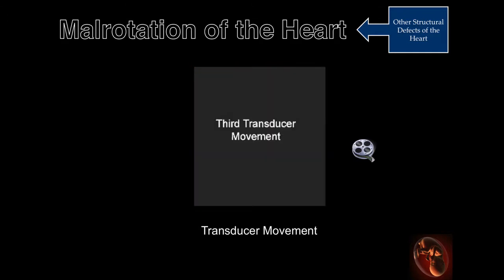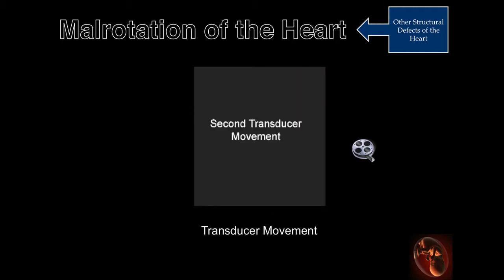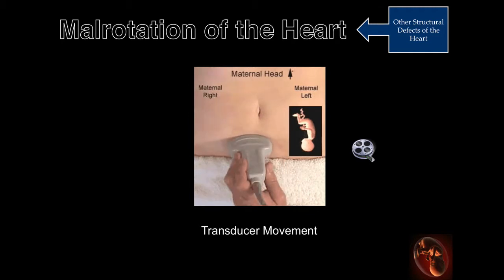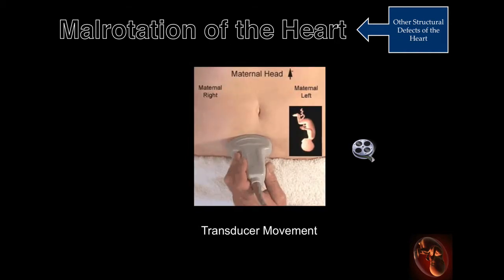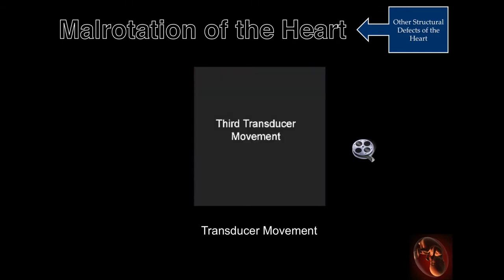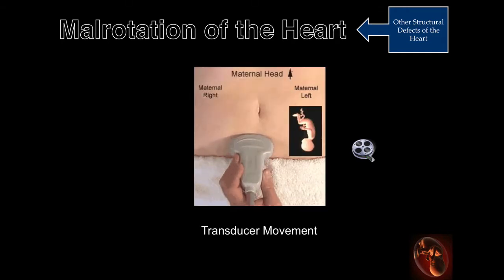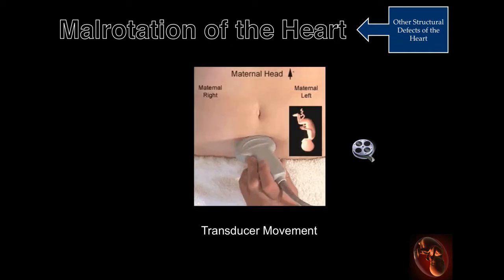One of the more difficult challenges is the identification of correct situs in the fetus. The next two slides will illustrate one technique for accomplishing this task. This clip illustrates movement of the transducer when the fetus is in the vertex position. The examiner is facing the monitor; the examiner's right is facing the left side of the monitor, and the examiner's left is facing the right side of the monitor. The examiner is facing the head of the patient. By lifting the transducer edge off of the maternal abdomen, the examiner can confirm that the above relationships are present, as illustrated in the next slide.